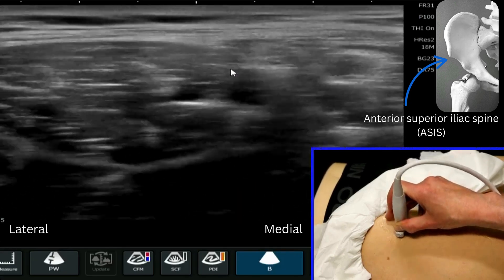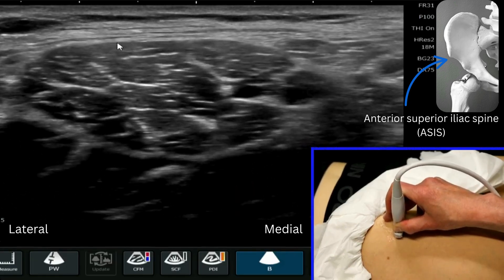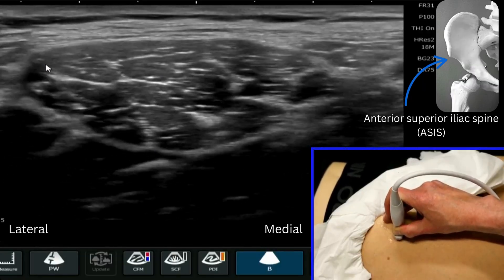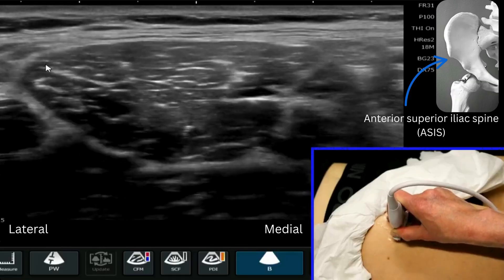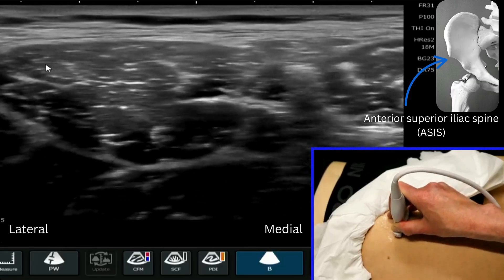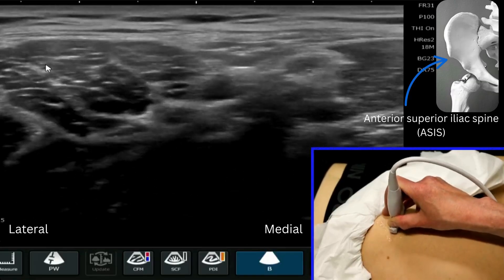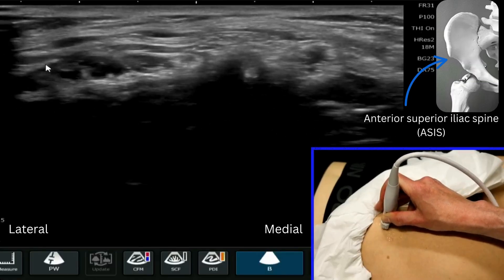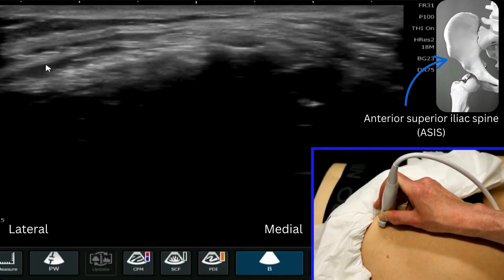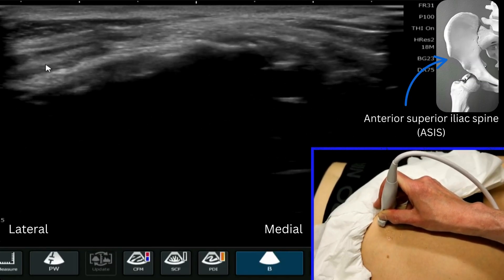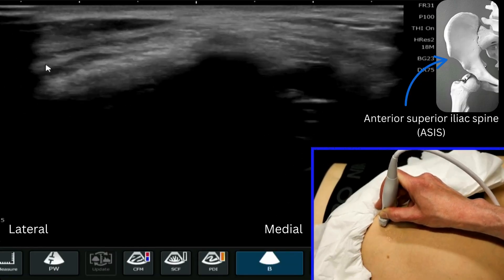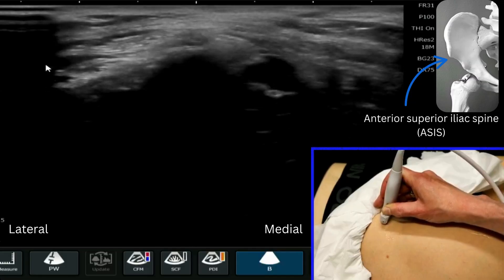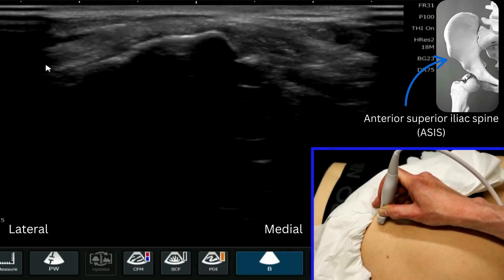If we follow the more lateral aspect, this is a more rounded, slightly more oval-shaped structure, and that is the tensor fasciae latae. Now when we scan more proximal, you can see that the tensor fasciae latae goes to the lateral aspect of the ASIS, and the sartorius goes to the medial aspect where they insert.